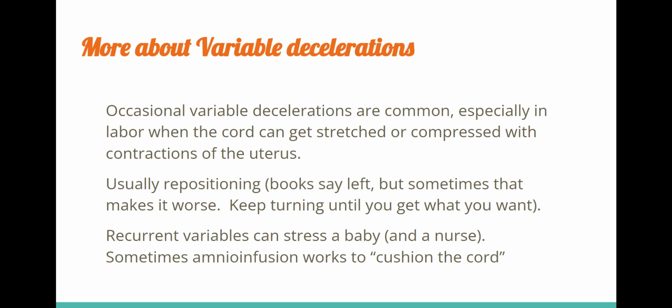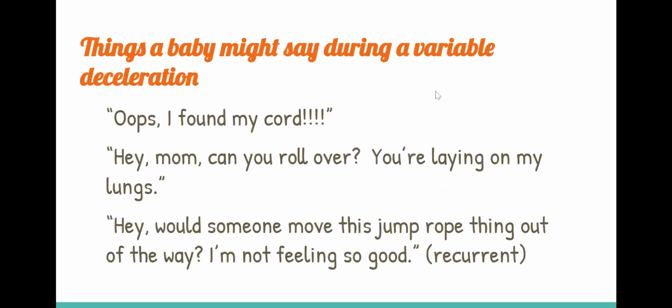Recurrent variables stress babies, they stress nurses, they stress providers, midwives, doctors, all of us. And sometimes we will go to that amnio infusion, using that IUPC to instill fluid into the uterine cavity.